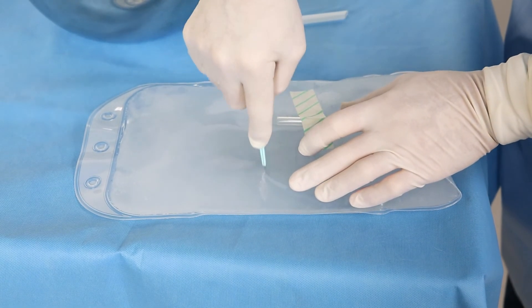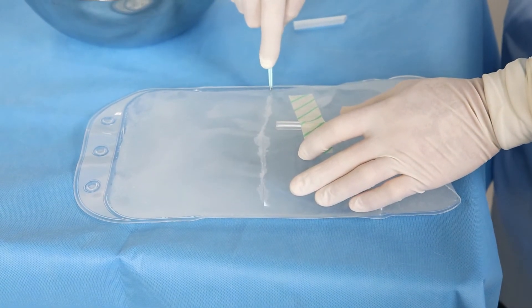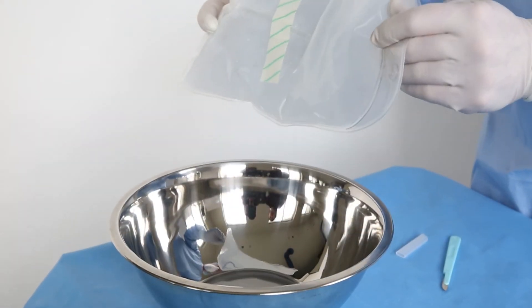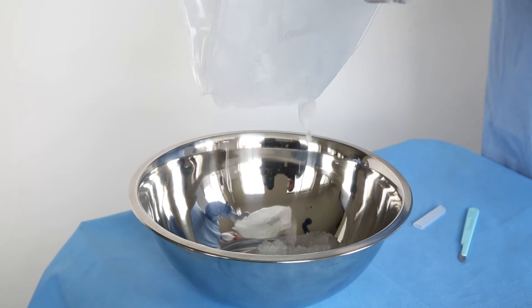Using a sterile scalpel, cut the bag down the center, fold and pull the ends toward you to expel the slush into the desired location.